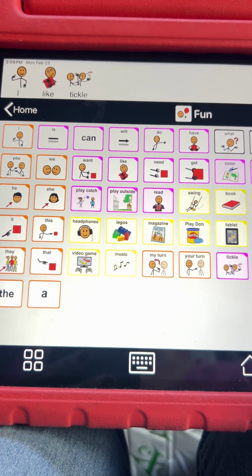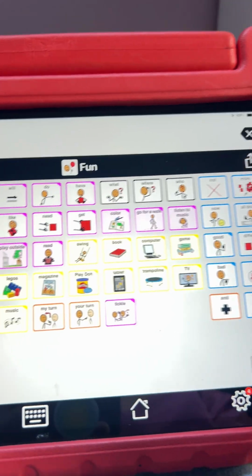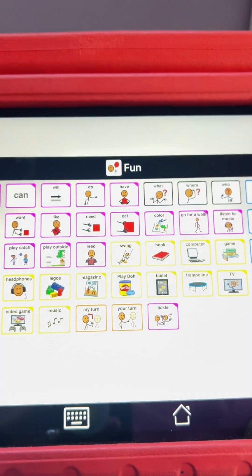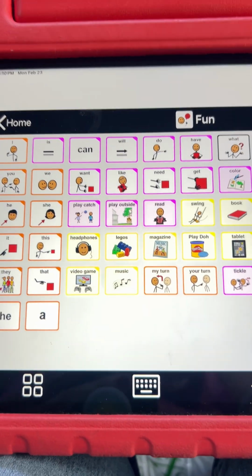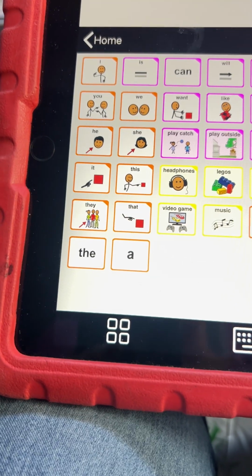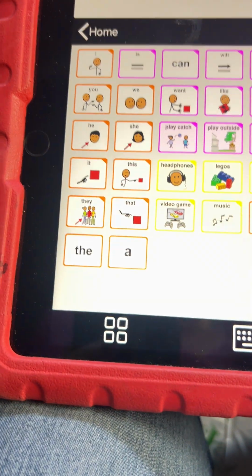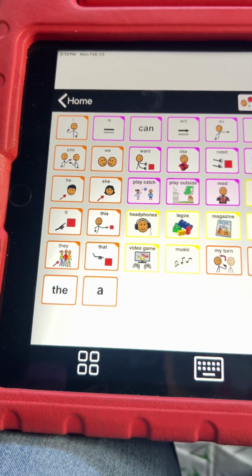And then I'll go as far as to say, more, more, more tickle. That gives you practice of having those words that mean need and want, which is definitely a preferred thing. So they're going to get that connection that much faster.